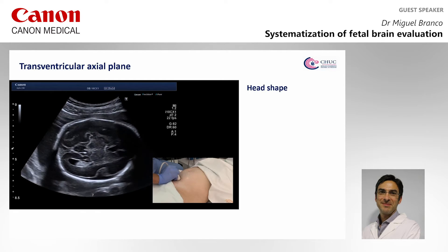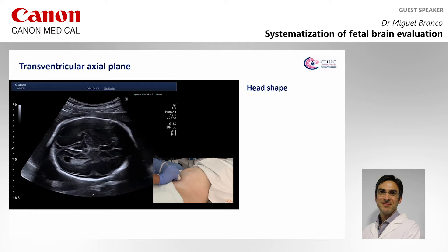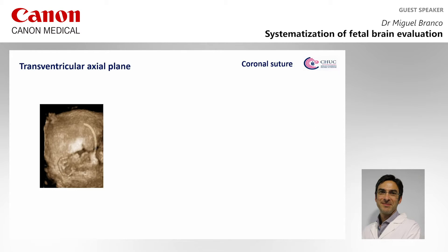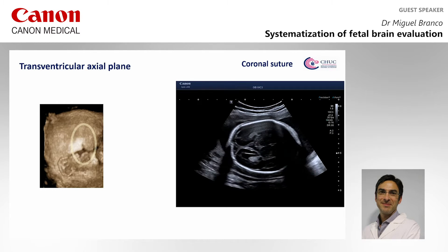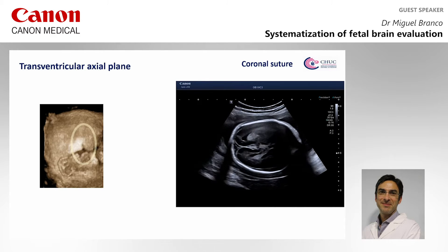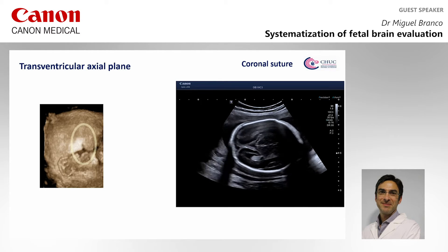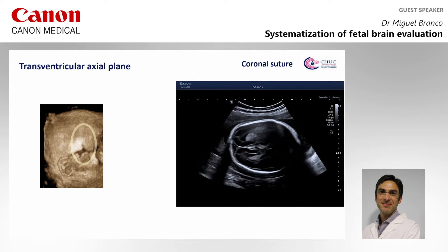In this plane, we evaluate the shape of the head and the continuity of the cranial bones. We also identify the coronal and lambdoid sutures, which are our acoustic windows. If we have premature closure of the sutures, as in this case of craniosynostosis, the corresponding part of the brain will be difficult to evaluate, as we have shadowing by the bone.